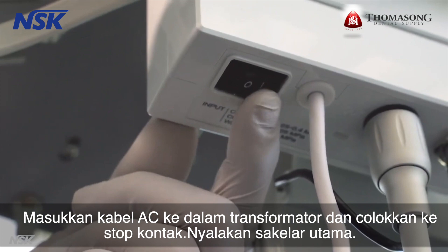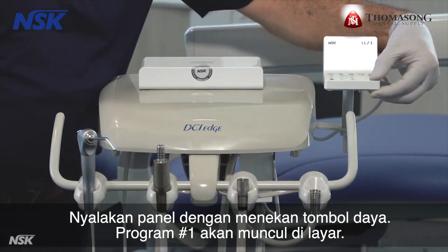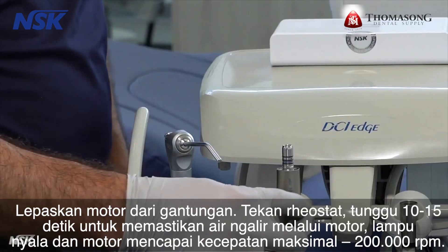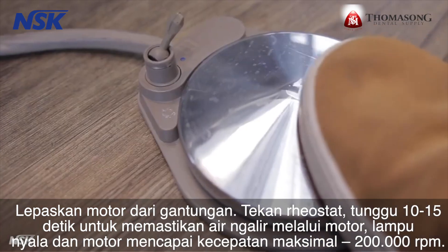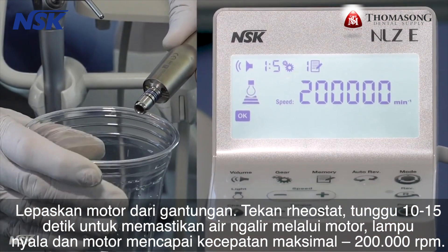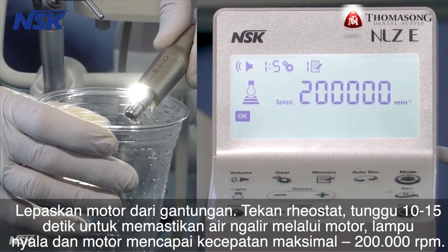Turn on the main switch. Power on the touch panel by pressing the power button. Program number one will show up on the screen. Remove the motor from the hanger and press the rheostat. Wait 10 to 15 seconds to make sure water runs through the motor, the light turns on, and the motor hits the max speed of 200,000 RPM.